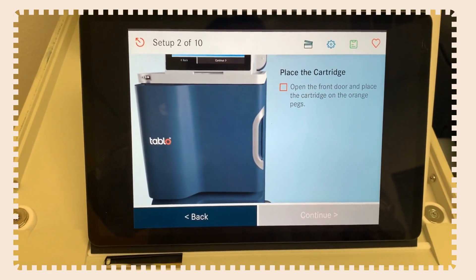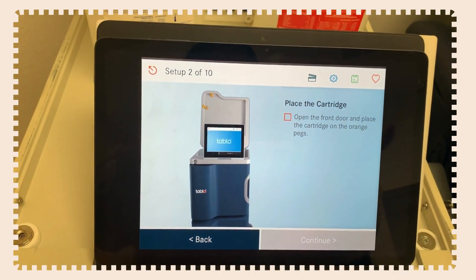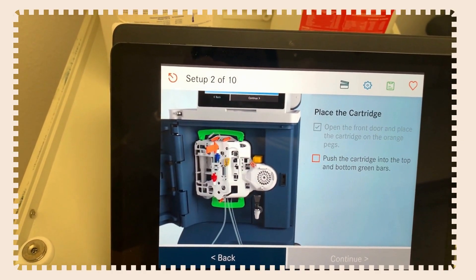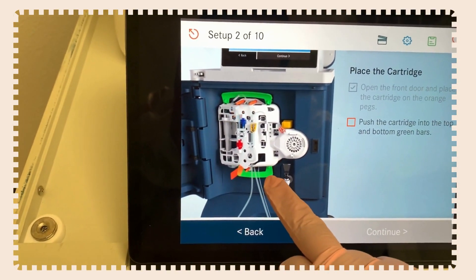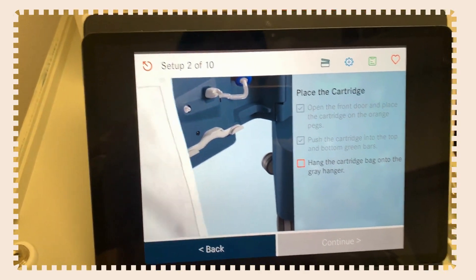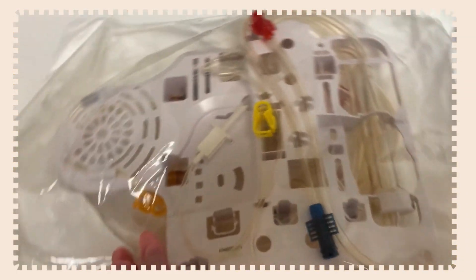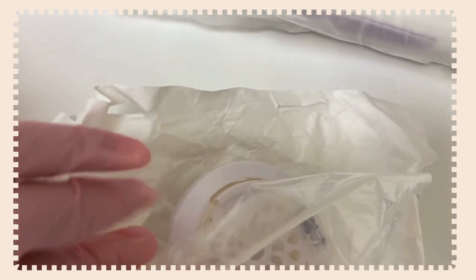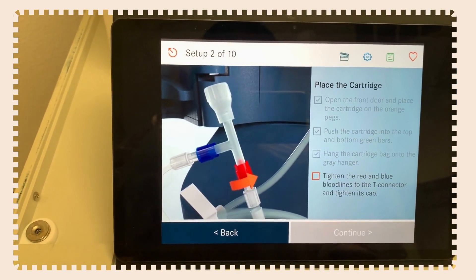Now let's place the cartridge. Open the front door and place the cartridge on the orange pegs. Pull the bloodlines down from behind it so it fits in its secure place — you'll know it's seated because you'll hear a snapping sound from the green bars. Take the bag the cartridge came in and hang it on the side of the machine. When the machine primes the bloodlines to remove air, it will dump the saline solution into that bag, keeping everything sterile.